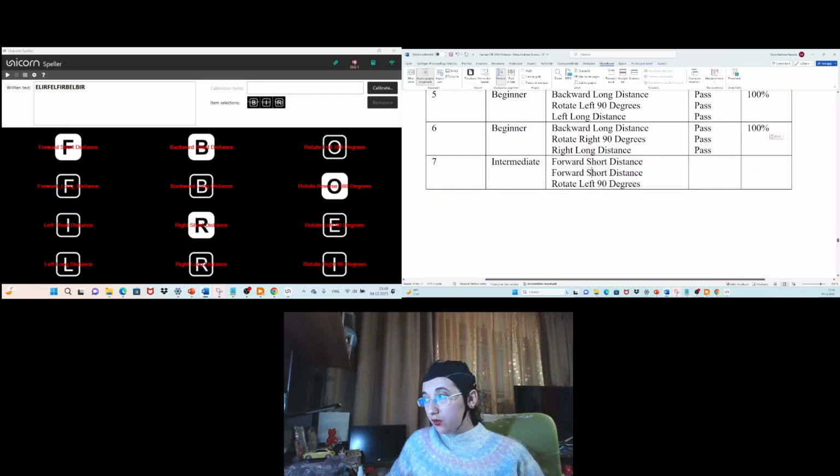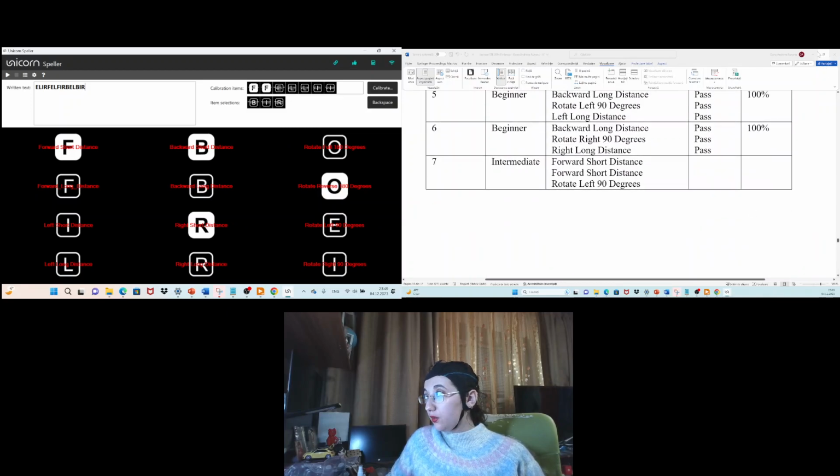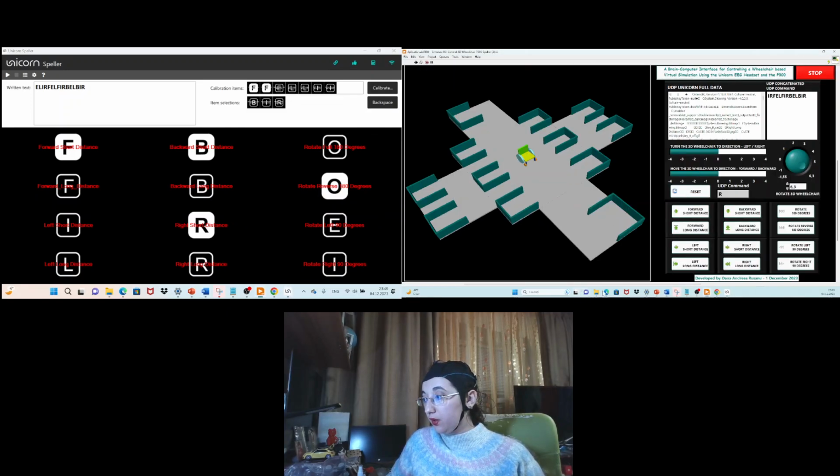Let's check them. So here forward short distance, then again forward short distance, then rotate left with 90 degrees. After that, left long distance, again left long distance, left short distance, and rotate right 90 degrees. So these are the 7 commands that I will focus on. Let's begin. Here, reset, and the 7 position, as I remember, should be here.